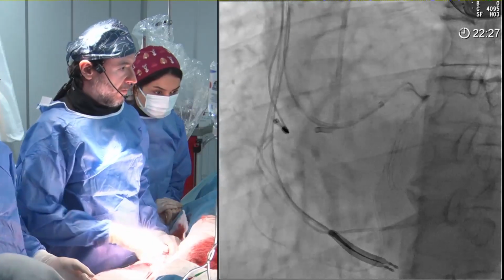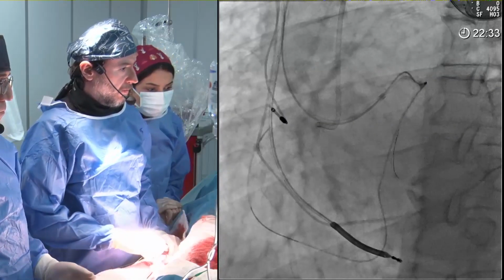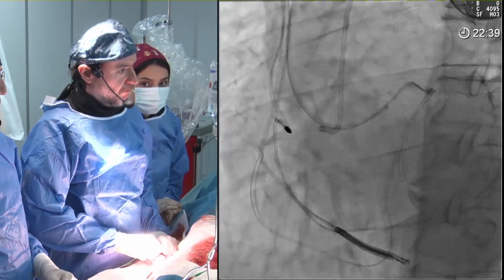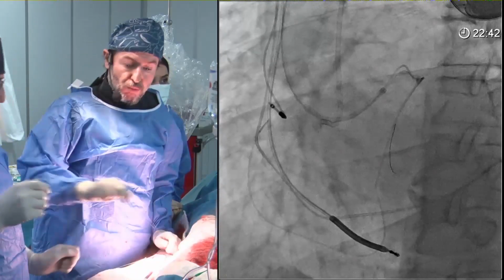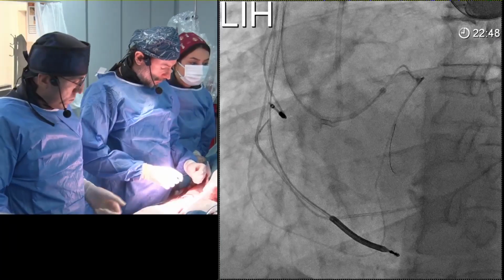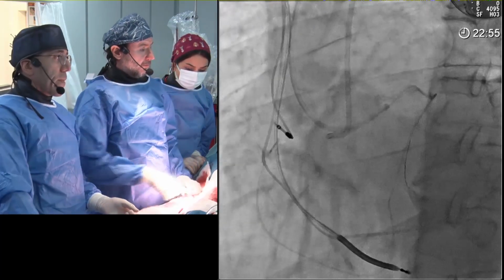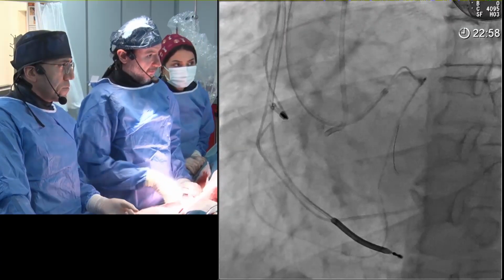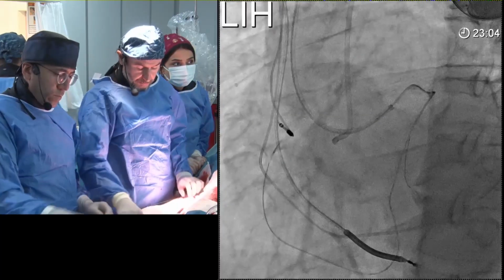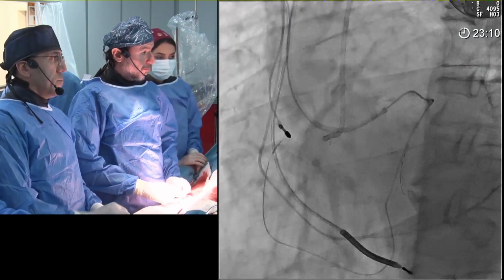Okay, Stefan. Just a quick suggestion here. What I like to do in these ostial cases, I totally agree with what was said so far. As much as I love transradial, in this case going femoral is not only about the support, it's the fact that your guide will be moving in phase with the breathing. When you're coming radial, it's not moving in phase with the breathing, because the catheter stays upward, and when your diaphragm goes down, the catheter stays up. So when you don't have any good contact with your ostium, you need to go femoral.